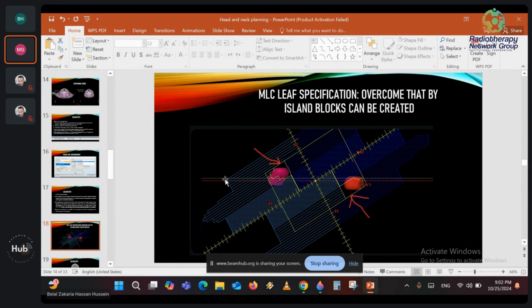What kind of patient-specific QA are you doing? We do patient-specific QA for nasopharyngeal cases and the different VMAT cases using a 3D phantom by the IBA system, to check the patient before starting the full arc, without deviation of the dose distribution.